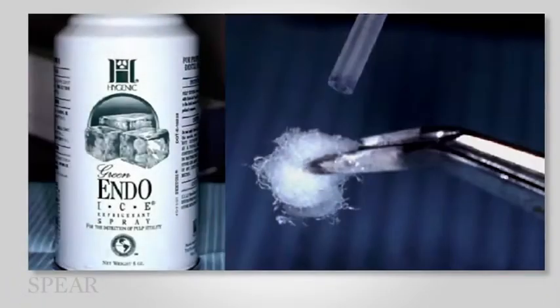Cold test has been shown to be more accurate than electric pulp test, and also more accurate than the heat test. So in terms of reliability, cold test first, EPT next, heat test last. And the cold test is, most people do it using a Q-tip. And I think I probably recommend that we use a Q-tip first using a refrigerant such as endo-ice, for example, as the first step.